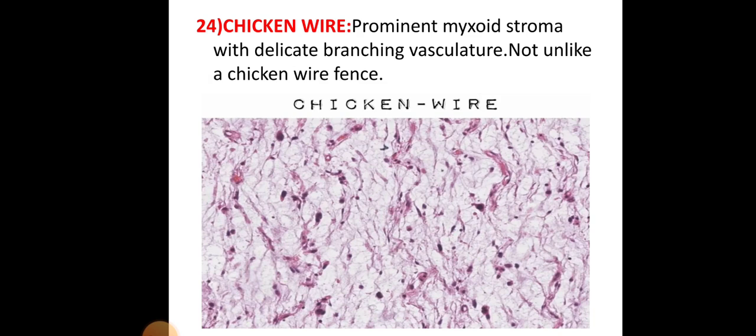The chicken wire pattern is where prominent myxoid stroma is seen with delicate branching vasculature, not unlike a chicken wire fence pattern.